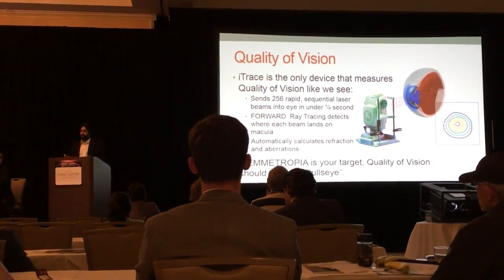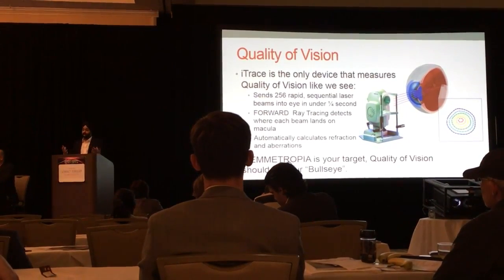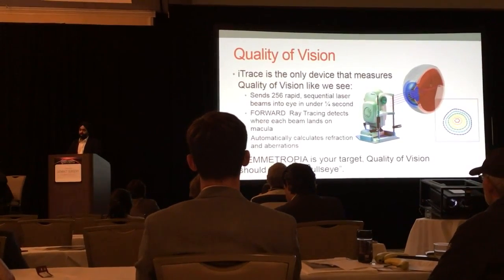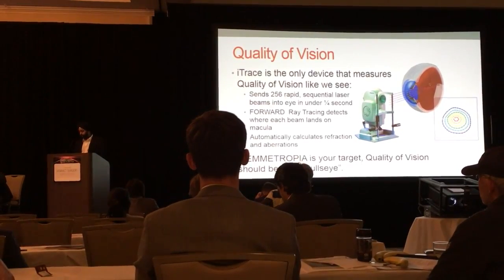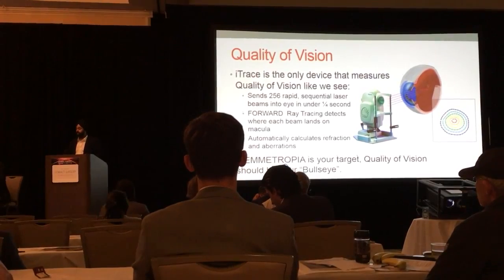And so it gives us information on higher order aberrations, contrast sensitivity, and a scatter plot of opacity. It gives us a refraction, and because it has a topographer built in, it can separate and give us the contribution of the cornea and internal optics. So for me, even when I'm planning any kind of cataract surgery, this is an indispensable tool.